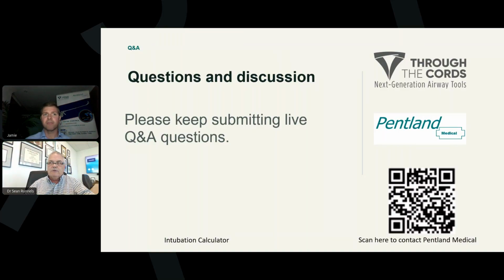I think they were out in 2023. If you read those, they recommend having the ability to have dynamic introducers and the ability to execute a combined or a hybrid technique should be immediately available when approaching difficult airways.